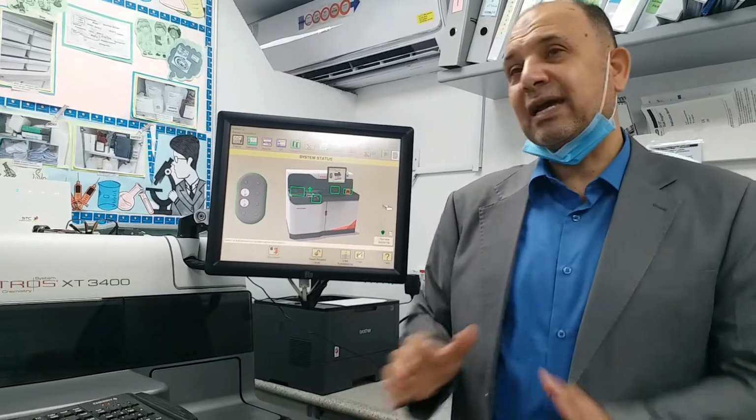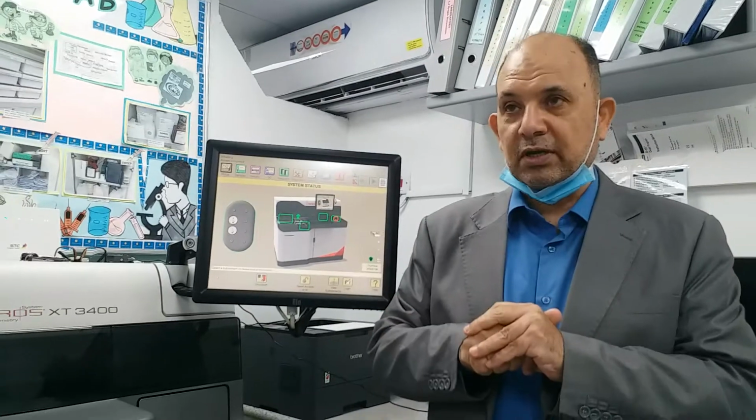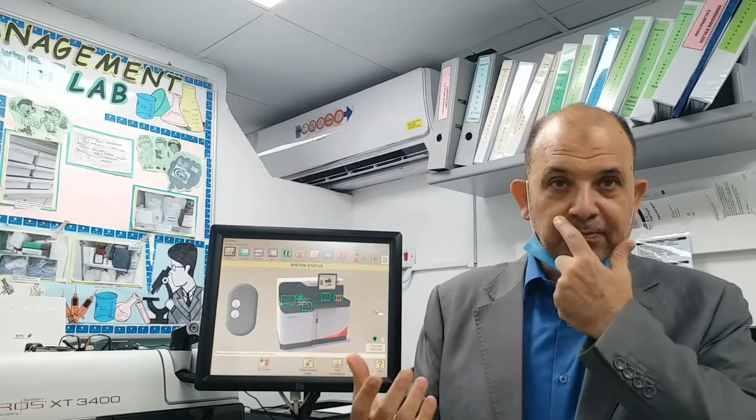That one will actually reduce the cost a little bit. Number two, it will also reduce the time to receive the sample. Instead of running, say, 4 minutes for the two tests, it will be only 2 minutes for the two tests. So the capacity will be higher.